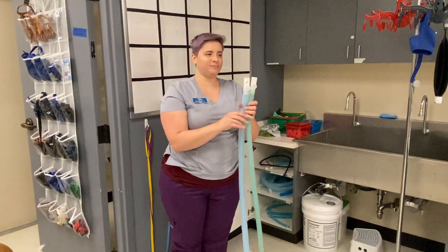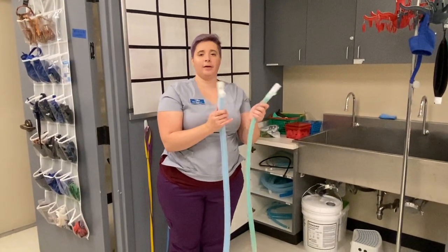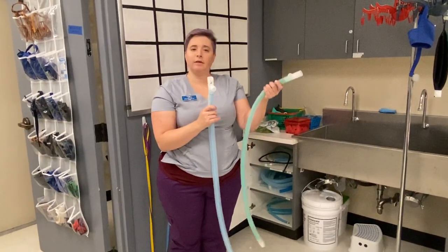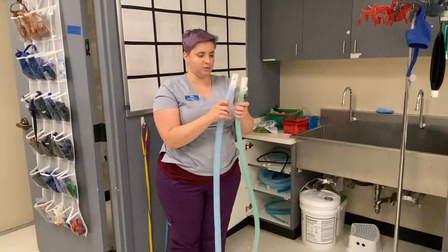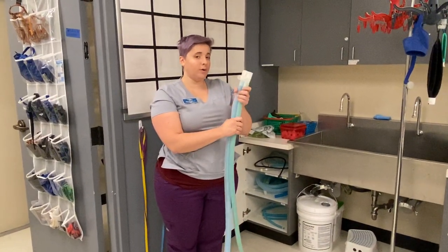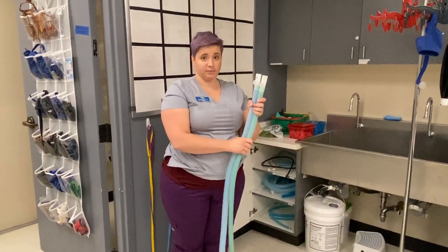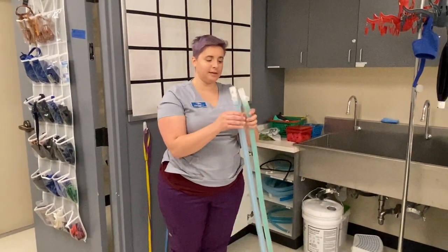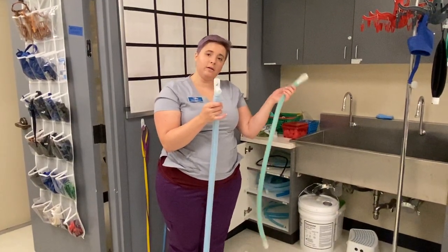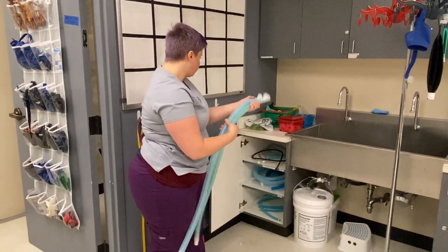There isn't an exact math behind it, but we've all agreed that around 45 to 50 pounds, go with the big one, and anything below that go with the medium size. These are for animals that should be on a rebreather, which are animals greater than seven kilograms. So if they're over seven kilograms, the next question is where do they fall — are they around 15 kilograms or more like 25 kilograms? You'll pick one accordingly.